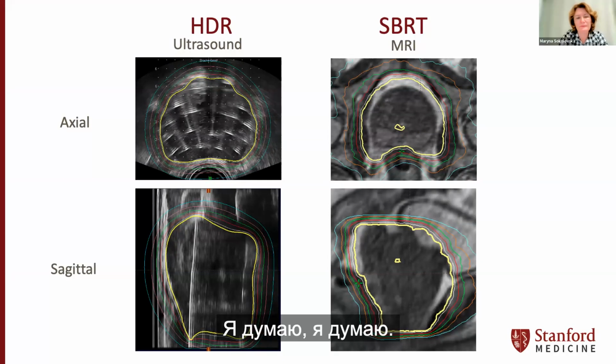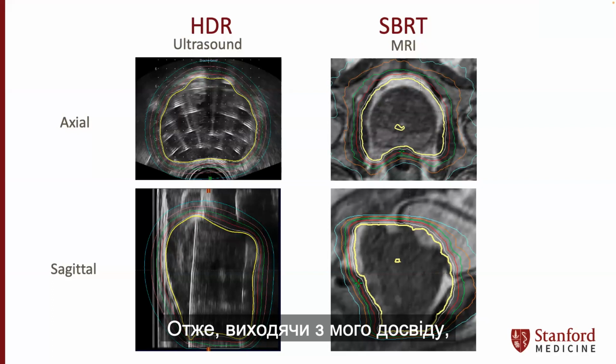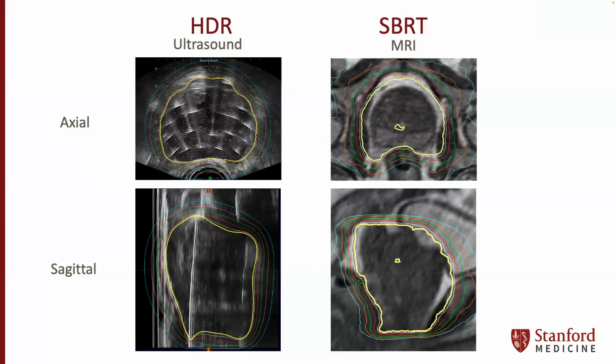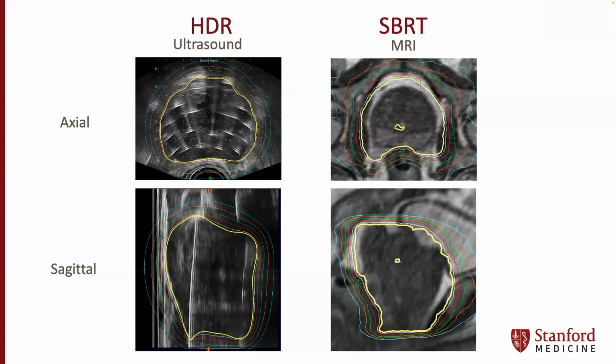Based on level of experience, I think spacer use should be individualized. I don't routinely use rectal spacers.